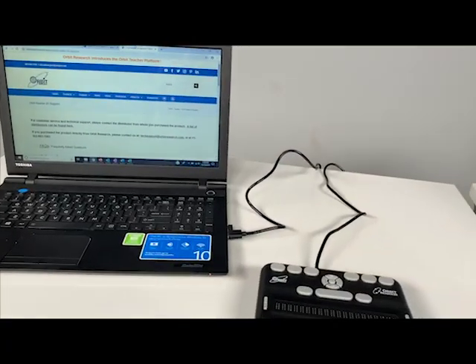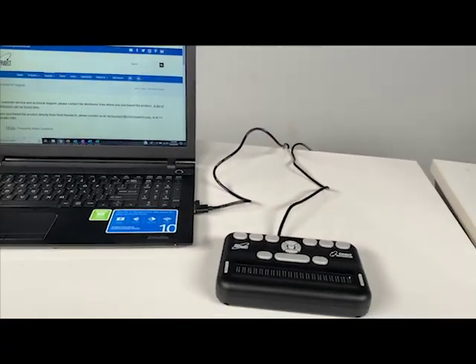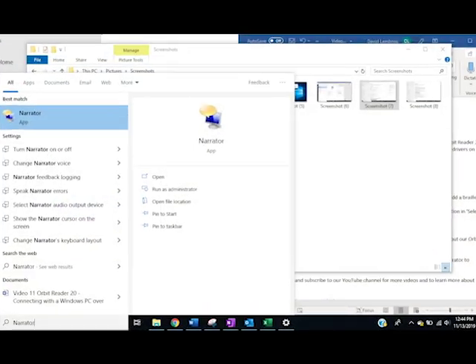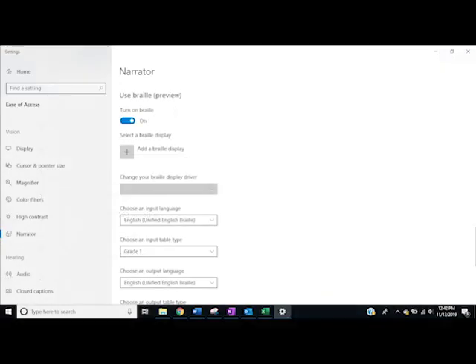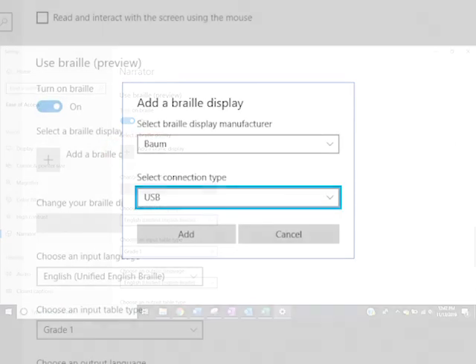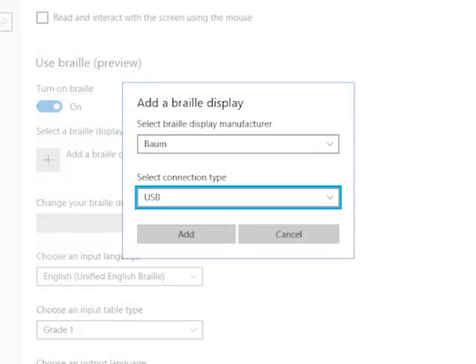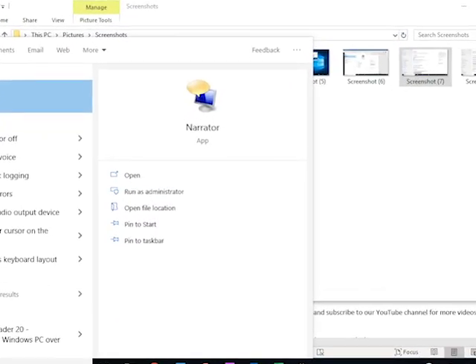Now, connect the Orbit Reader 20 device to the PC by USB cable. Start or restart the Narrator application. Open the Narrator settings window and turn on Use Braille, and add a device by clicking the Add Braille Display option. Select BAUM for the braille display manufacturer, and then select USB for the connection type. Then press Add. Restart the Narrator application.